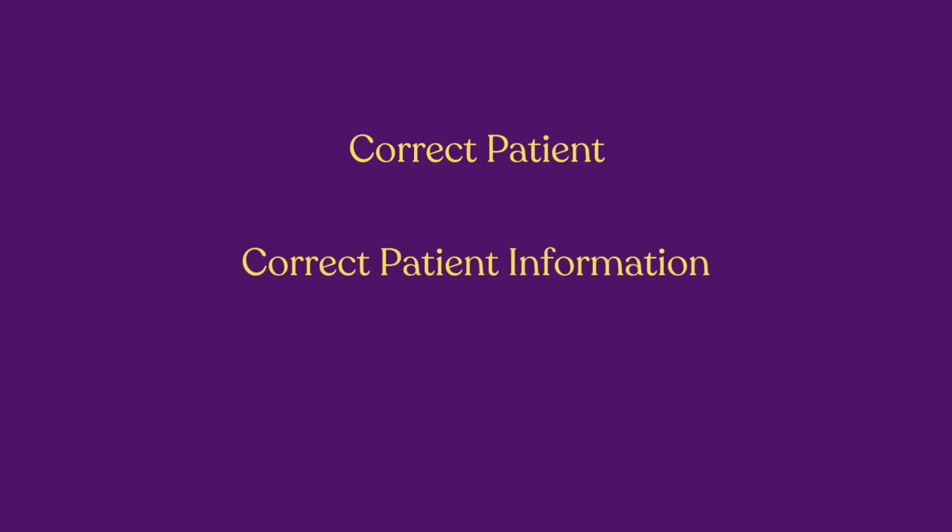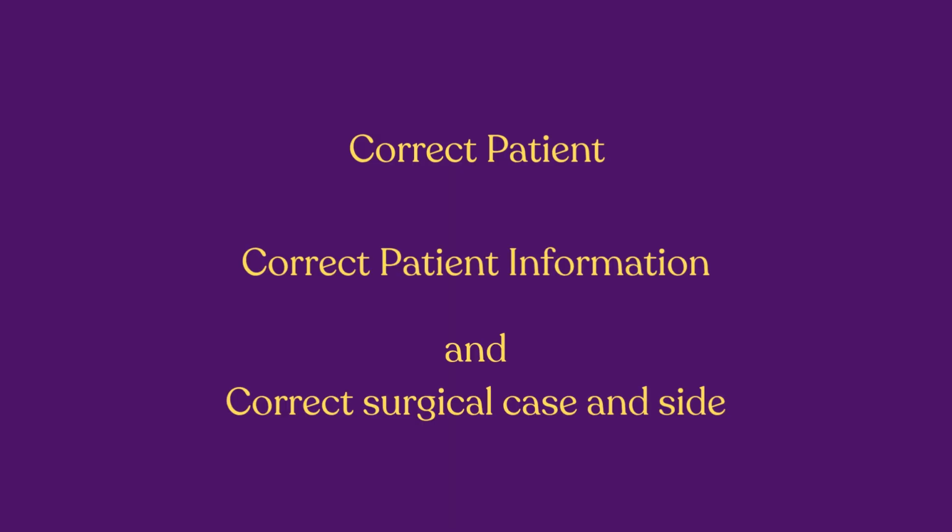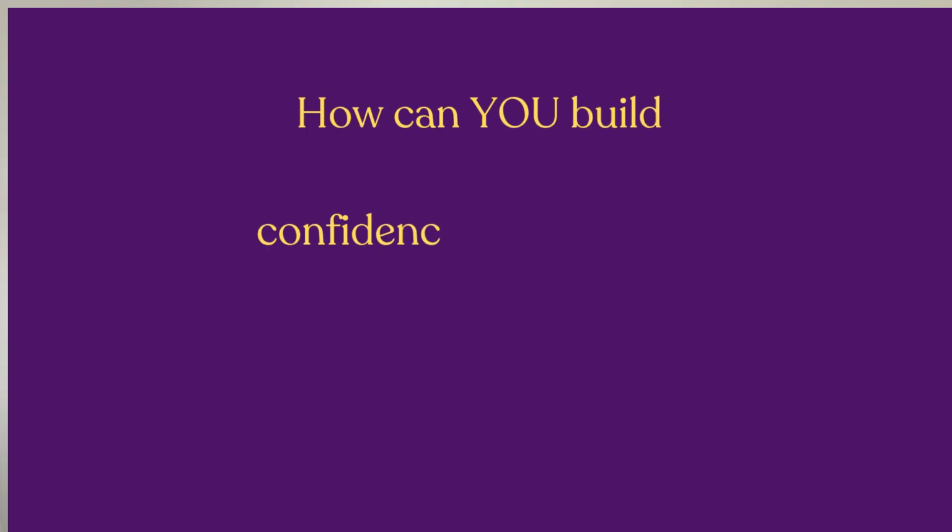Take an extra 10 to 15 seconds to double check that you have the correct patient information, and the correct surgical case ordered for the patient before the case begins. This small habit will prevent major mistakes and help you build confidence fast. How can you build confidence as a student or a new tech? Confidence in the OR comes with experience.